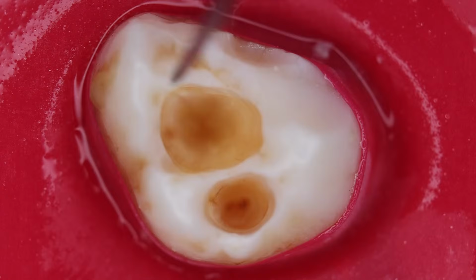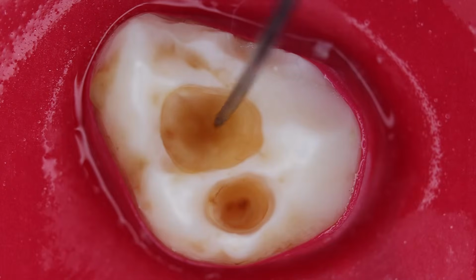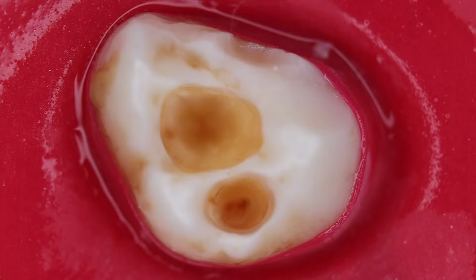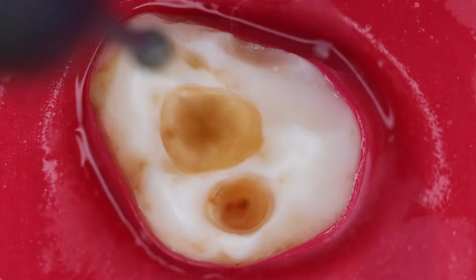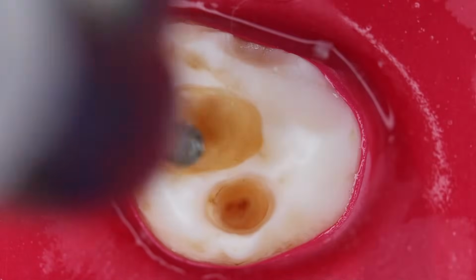Over here, this is the mesial cusp, so the chances are that the mesiobuccal canal would be located underneath the tip of this mesiobuccal cusp, somewhere over here. The distal would be located somewhere over here, and the palatal would go over here, roughly inside this. So we are just undermining the things, and we would go slowly. Now this is the time we would get the bur drop as we go deeper inside. So the approach should be slow and steady.